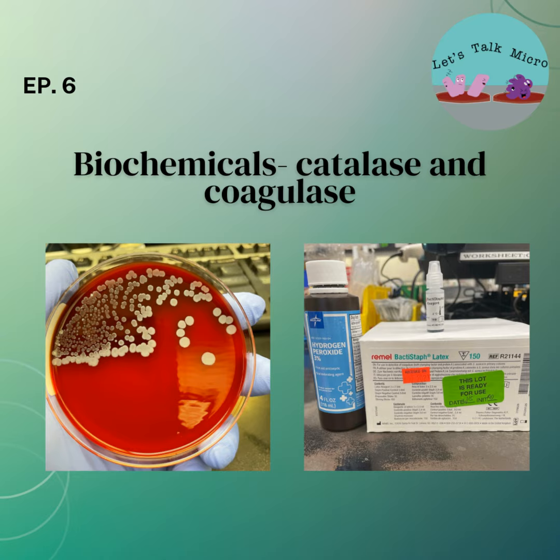And also with the alpha colonies, with elderly patients, you do a wet mount, you can see sometimes the cocci in clusters. If you're not sure, just go ahead and do an ID, not quick, but you can do a Vitek or a MALDI-TOF, whatever system you have, because you need to rule out Aerococcus urinae, which causes urinary tract infections in elderly patients.